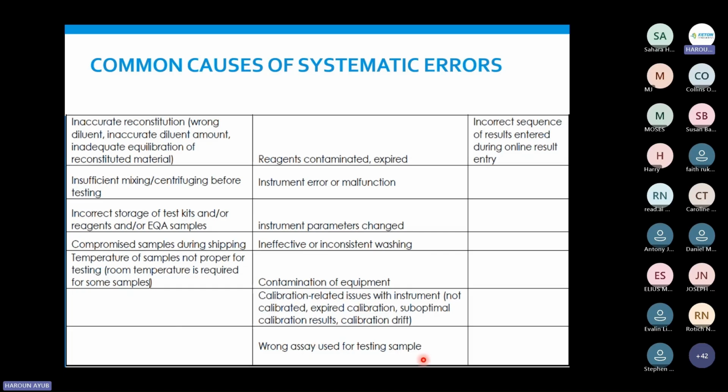So usually that's why you say if you're using automated systems, make sure that every morning you're able to check the scanning of the reagent and you're able to know which reagent is where. Because especially for high throughput labs or busy laboratories, you might find a team where one wants to put it this way and they interchange the reagents. If you don't know, they will be having issues.